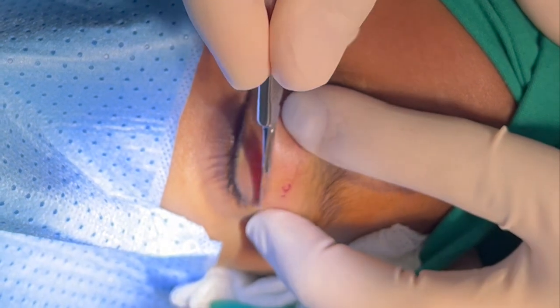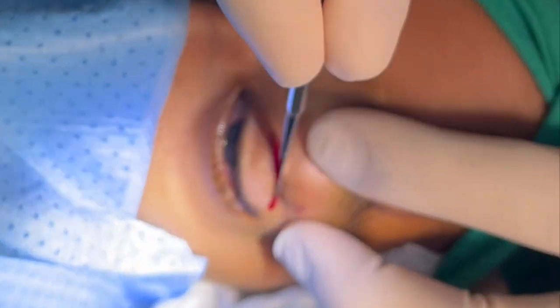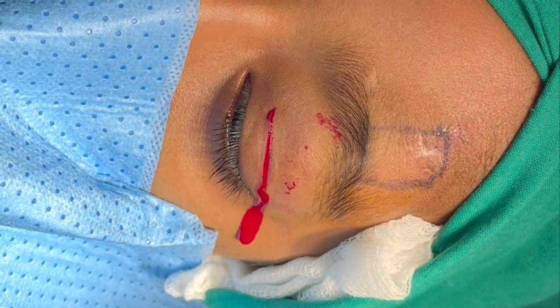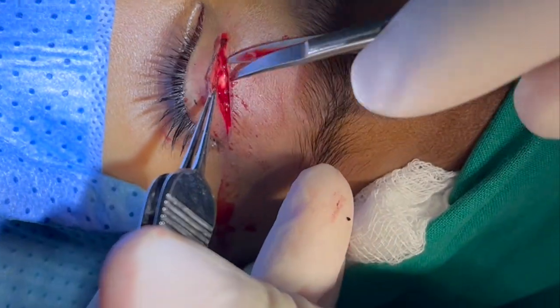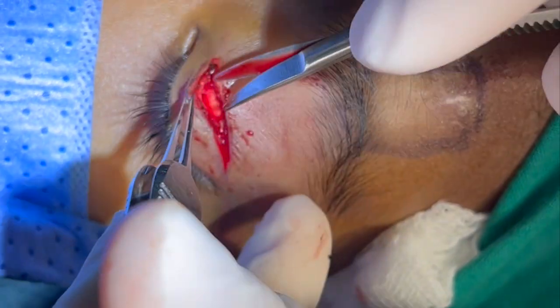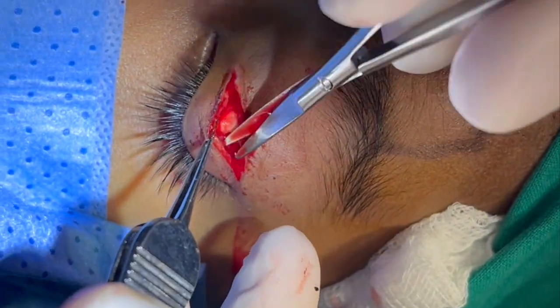The number 15 blade is used to create an incision at the eyelid crease through the skin and orbicularis muscle. Westcott scissors are used to create a pocket anterior to the tarsus to expose the tarsal plate and then superiorly over the levator muscle.